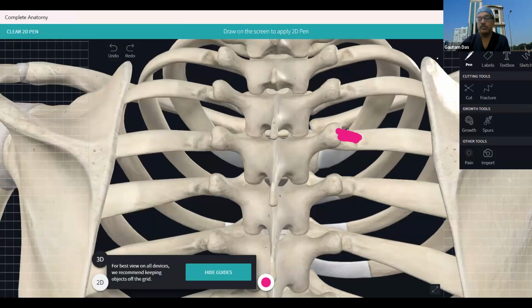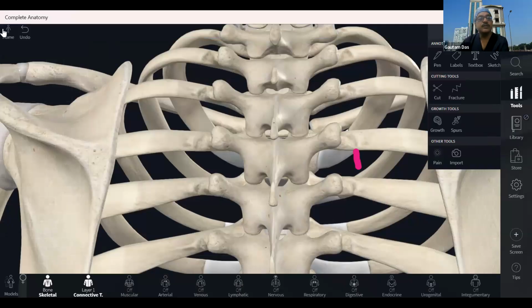For the paravertebral block, we normally go there. Either you pierce the superior costotransverse ligament obliquely out of plane, or you can come here. There is a membrane, and that membrane you can pierce. I'll be showing you.